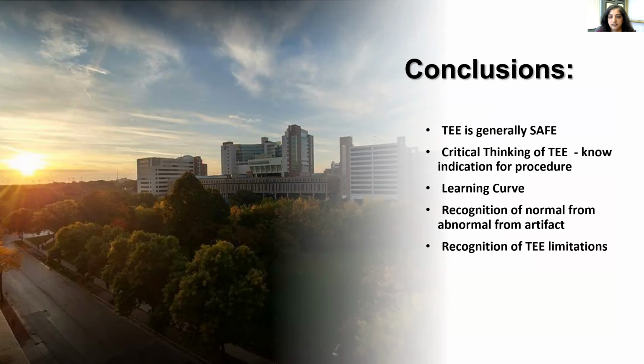You can expect some TEE questions on echo boards about normal TEE anatomy versus abnormal TEE anatomy versus artifact. And then recognition of the TEE limitations is also something that's very, very testable.